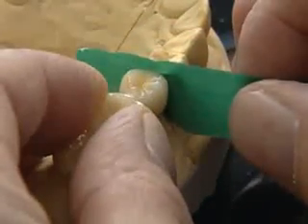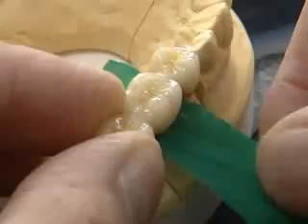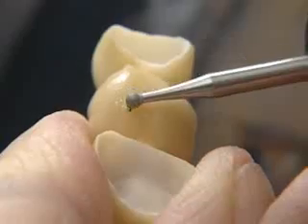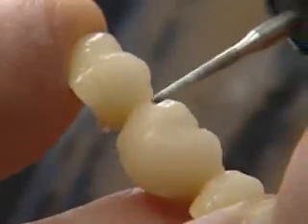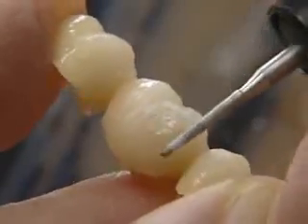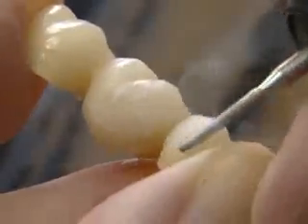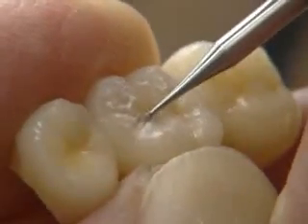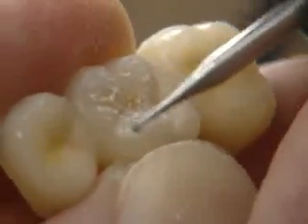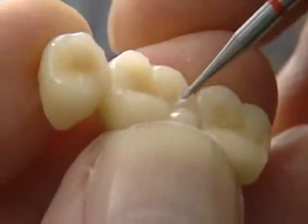All the proximal contacts and pontic supports are carefully ground in. Separated with a diamond disc, the outer form of the bridge is prepared. The occlusal morphology is ground in and outlined. Round, fine diamond instruments are suitable for details, and carbide tips as well for fissures, during the corresponding water cooling.